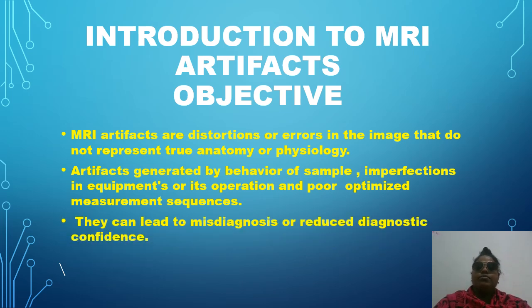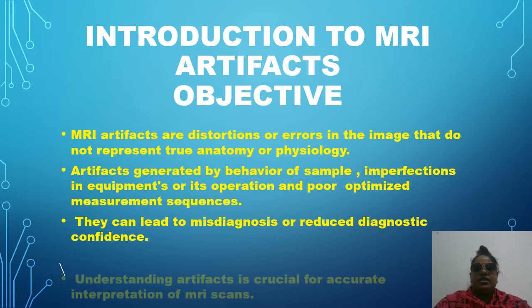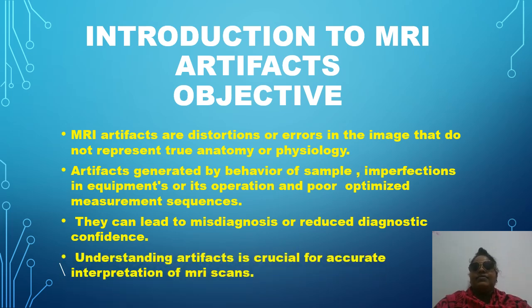They can lead to misdiagnosis or reduced diagnostic confidence. So understanding artifacts is crucial for accurate interpretation of MRI. We must know the artifacts to identify the correct or accurate pathology in our MRI images.